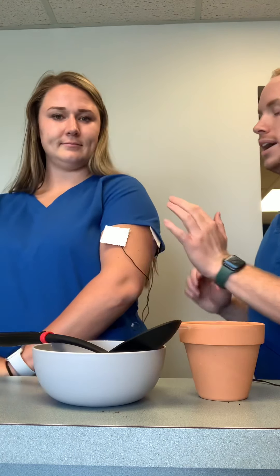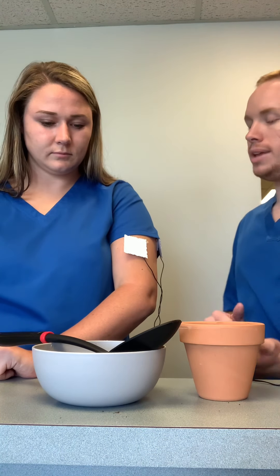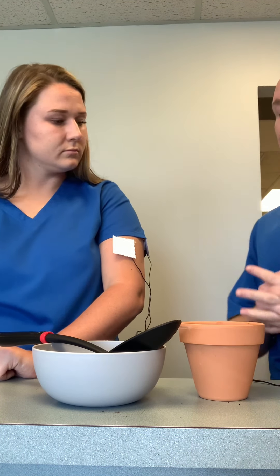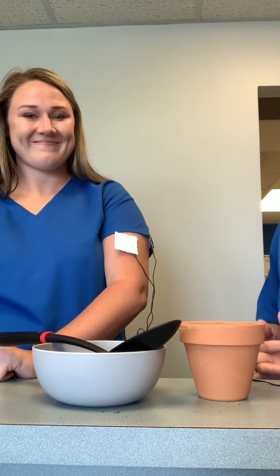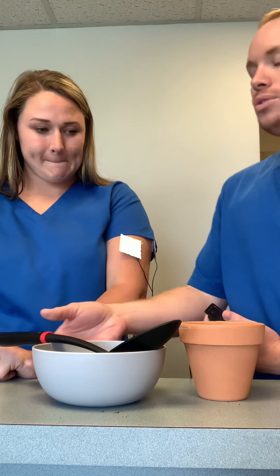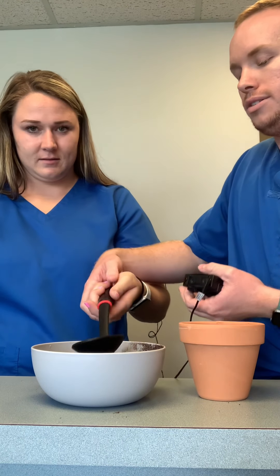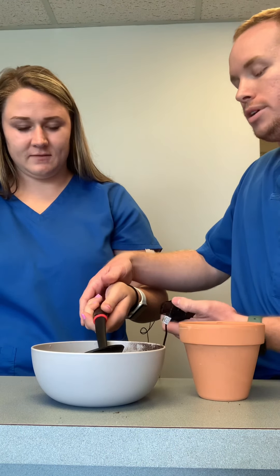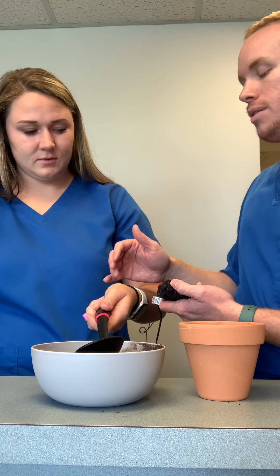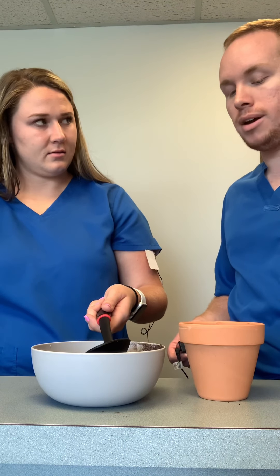You ready for your intervention? So I have your NMES device hooked up. What that's going to do is we're going to be able to activate the arm when we start our intervention. I do remember that you mentioned that you like to plant flowers and garden. So I'm going to have you grasp this spoon. I'm going to turn this on, get it at the proper voltage, and when it comes on we're going to be able to flex and kind of move over to the flower pot. I'll be here to assist you.